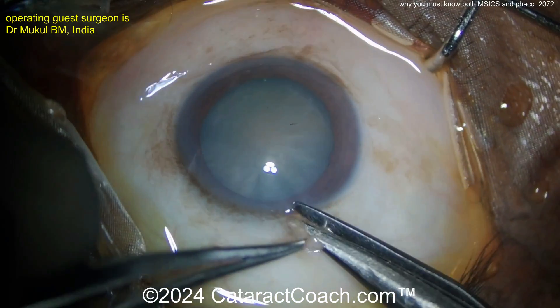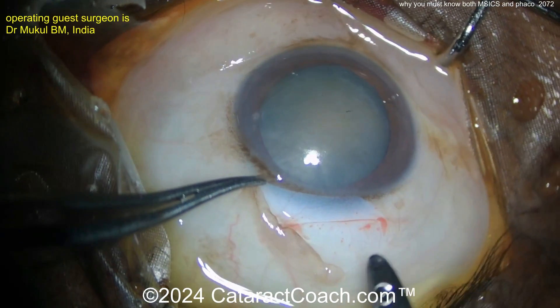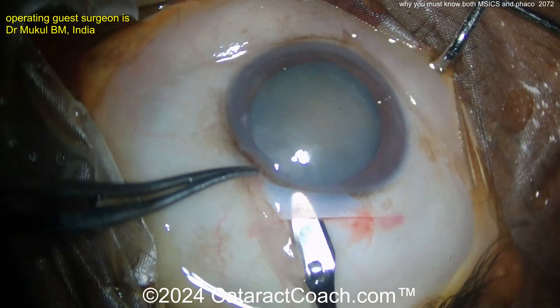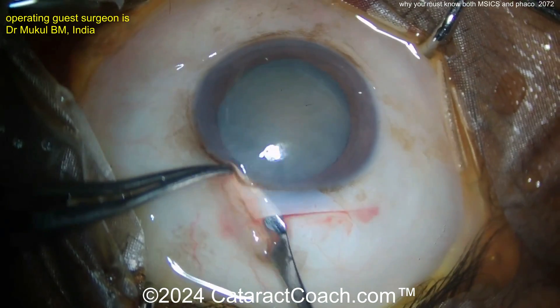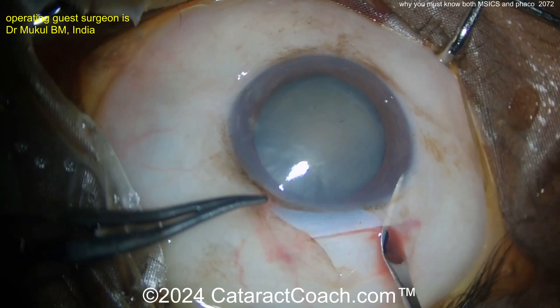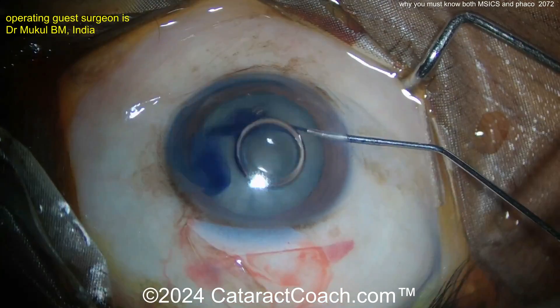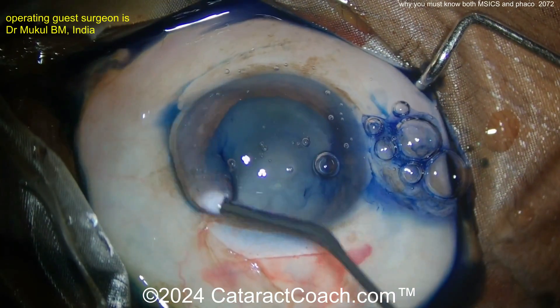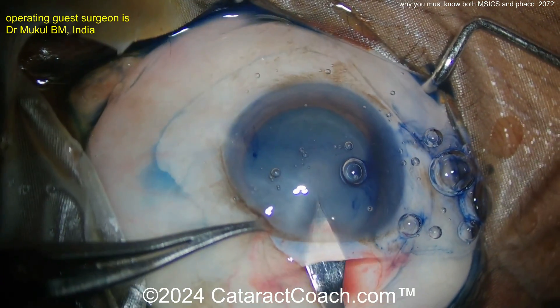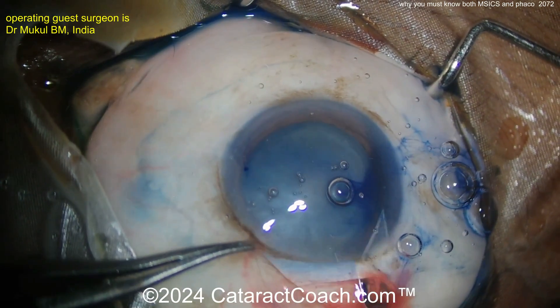Here's the MSICS. Look at the great exposure with the speculum in — so much great exposure, beautifully done. There's the incision. Now MSICS for my American colleagues is manual small incision cataract surgery, but think of it as manual shelved incision cataract surgery. Look at that incision — it's very shelved, a nice long tunnel length, and it's also trapezoidal. It's bigger on the inside than on the outside, which allows nucleus extraction. This long shelf incision allows the incision to seal really well with very few sutures, or sometimes even no sutures.